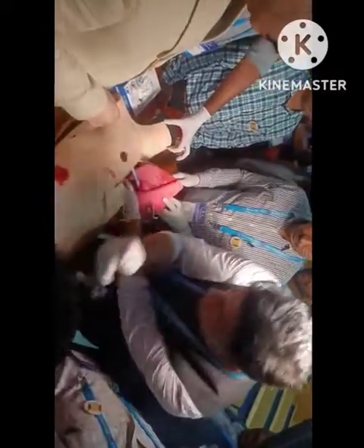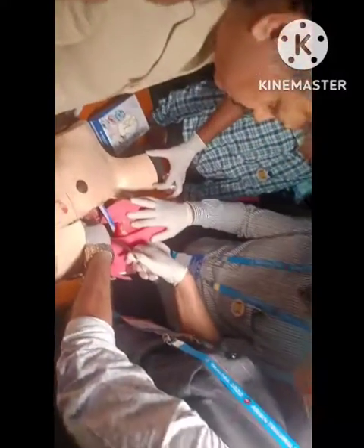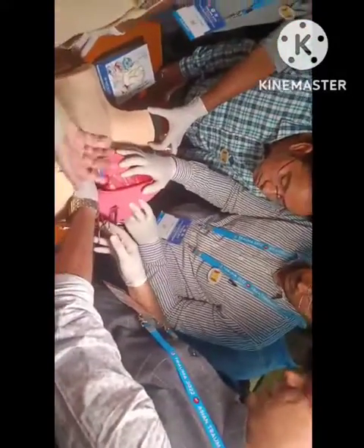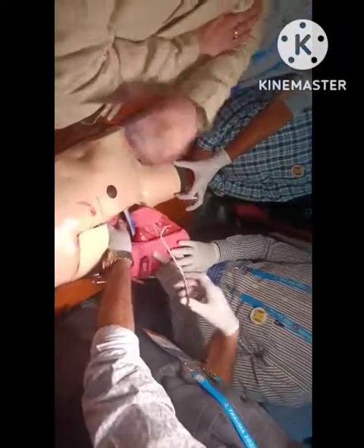For injury, that is like you did this procedure in the ED. Now you have to shift the patient to the OR. At that time you can put a Foley. Or you can also use the Satinsky clamp. Okay. How do you use that? You just put it like that. I'm not aware of this being used for this. Yes. Okay. You can put it like this. So this is a Satinsky clamp.